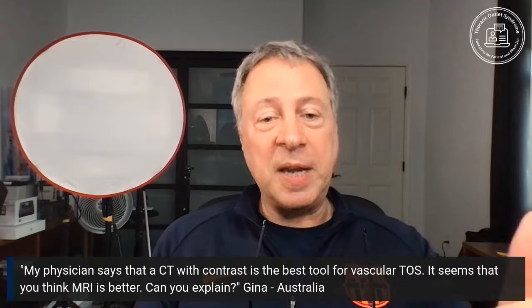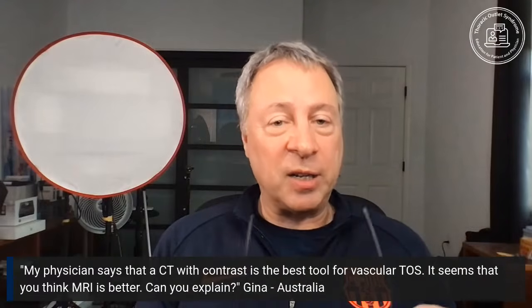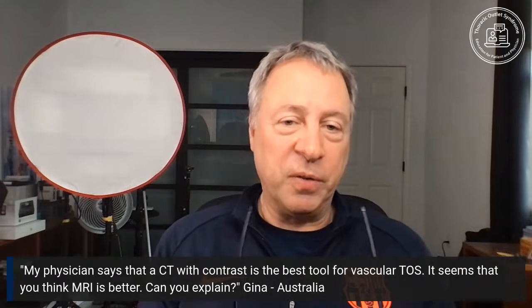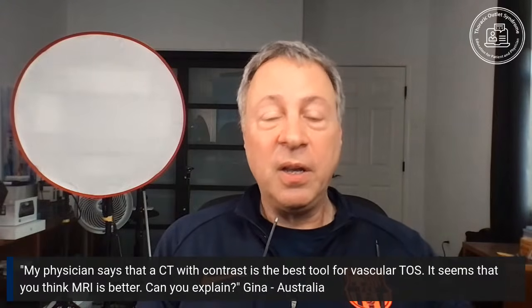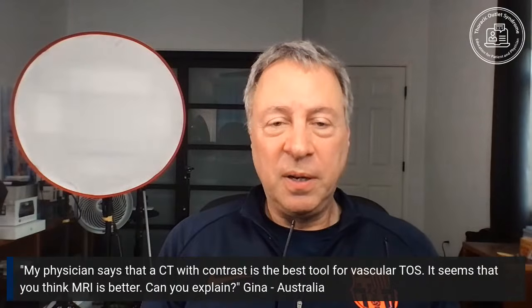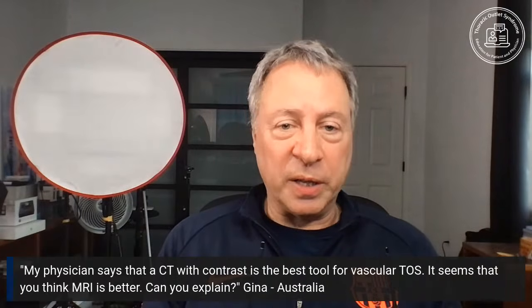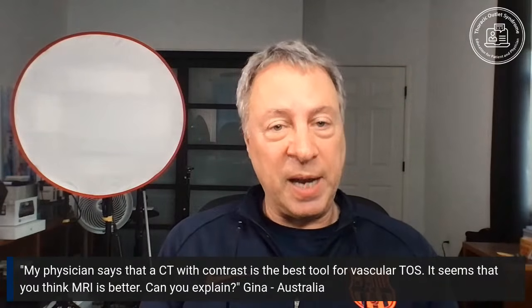Now that means you need to take your eyes off that picture and look at the other MRI images you got at the same time without the patient moving. So you could look for a little ligament or a fibrous band. You have to look for the rib and the collarbone. You want to look for the scalene muscles. For some docs who don't do this all the time, it's hard to move their eyes from one image to the next and put them together.